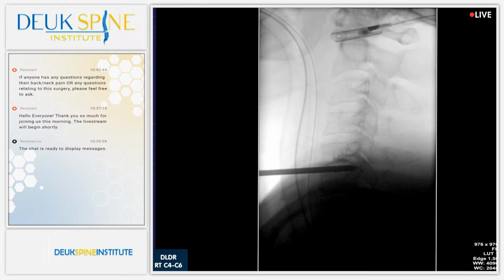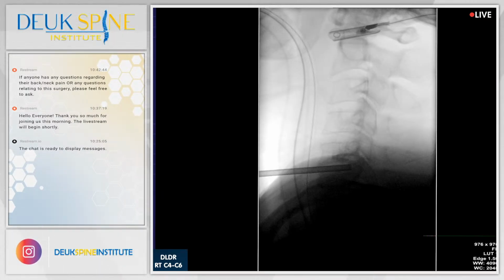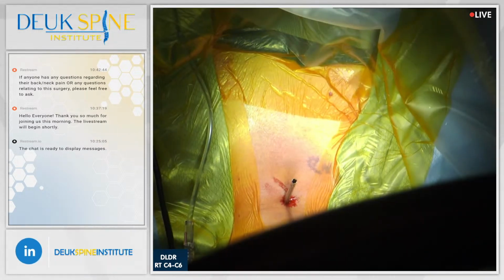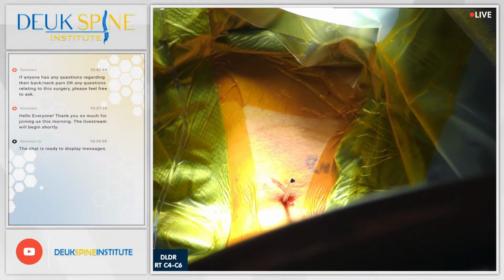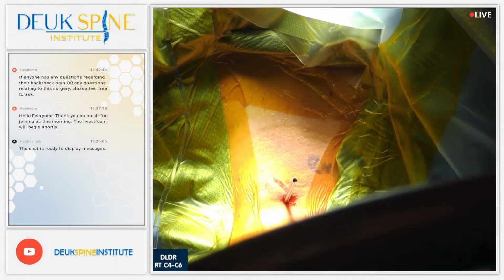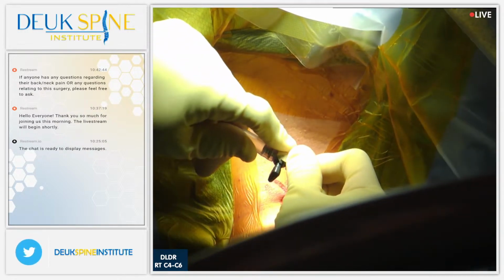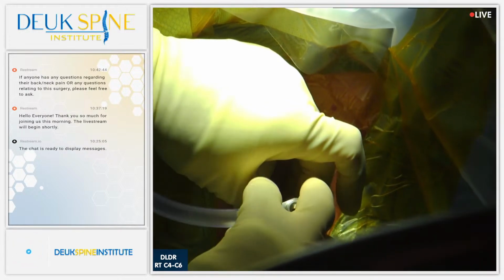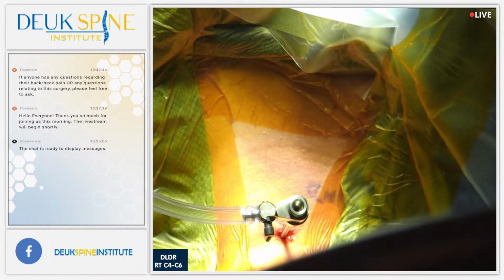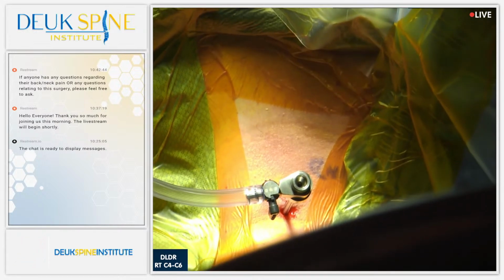We do that endoscopically. Because we're not taking the disc out in the front, we're not doing a discectomy, we don't need to put anything in the disc where the disc used to be. The only reason surgeons do a discectomy is to get to the piece of herniation in the back. But we're not going to do a discectomy. We're just going to go through the disc with the tube out the backside, and we're going to treat the herniation directly without taking the disc out.